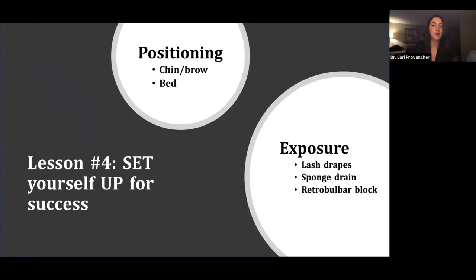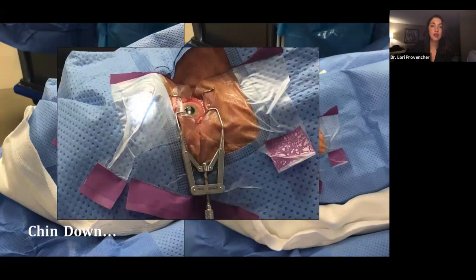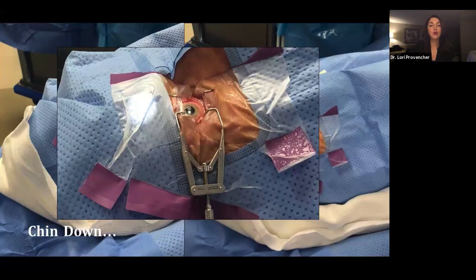So this is a picture taken of a patient who is draped really beautifully, great lash drapes. They've got the lid speculum in with the eye nice and wide open. But what you'll notice is if you zoom in, there's hardly any access to the superior limbus. So when you're doing FACO, you're often working with two hands, and you really need to be able to get your second instrument in there.